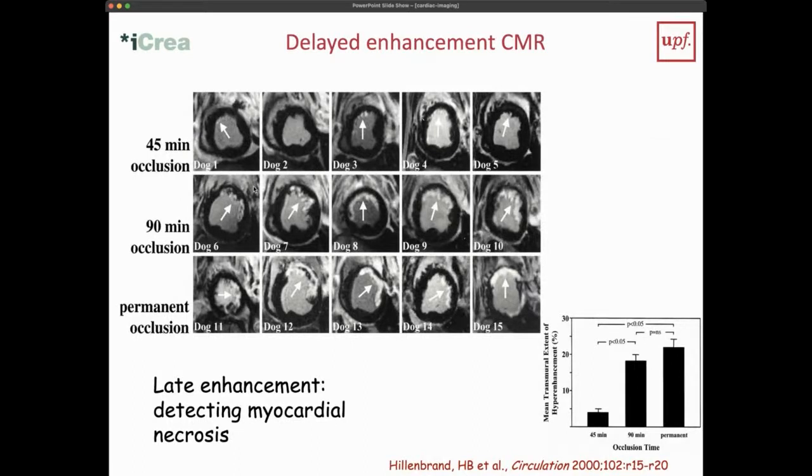What MRI is currently used for quite a lot in cardiology is to try to detect scar, to try to detect infarcts. What they noticed at some point is when you use contrast agents in MRI, gadolinium-based contrast agents, and you inject the contrast agent, that contrast agent first comes into the blood. And you can actually visualize this. So you can really see an opacification of the blood with a contrast agent.